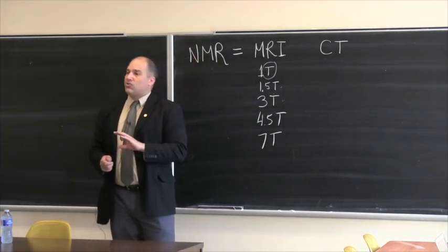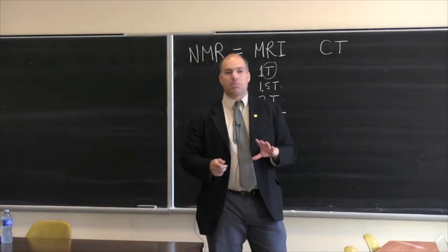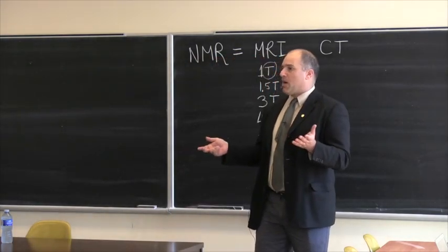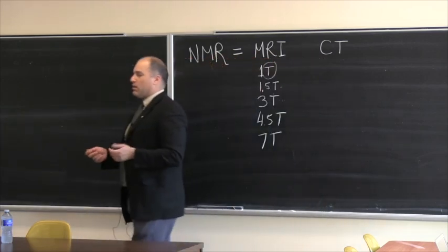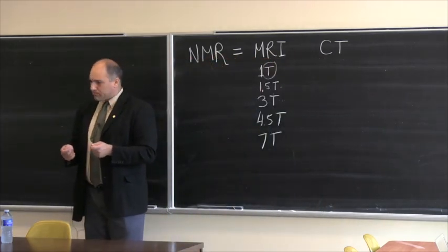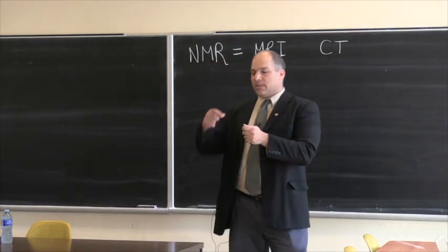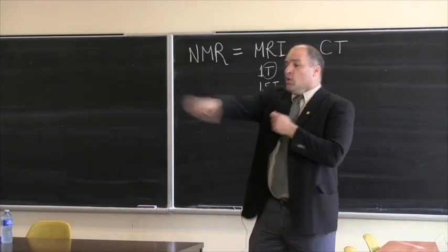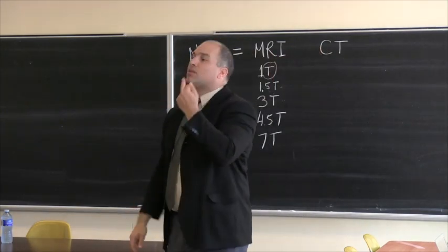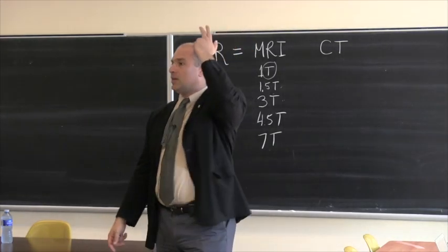So it's very tricky, and there are many, many problems with scanners in the sense that people just forget how powerful the magnetic field is. So we've had terrible experiences where a research assistant would walk into the scanner room with a piece of paper, and the staple from the piece of paper would just fly out and go straight into the brain of the person through the nostrils. It would just fly through the nostril into the brain and get lodged in.